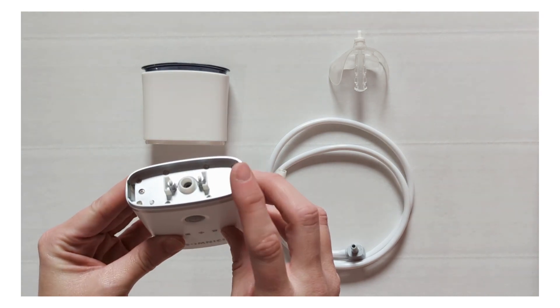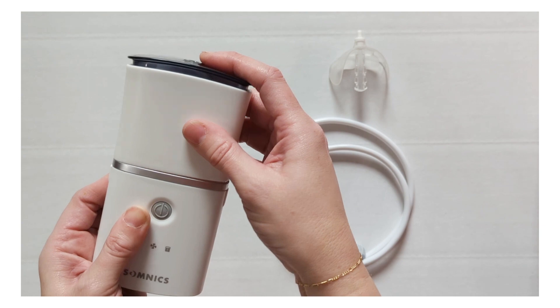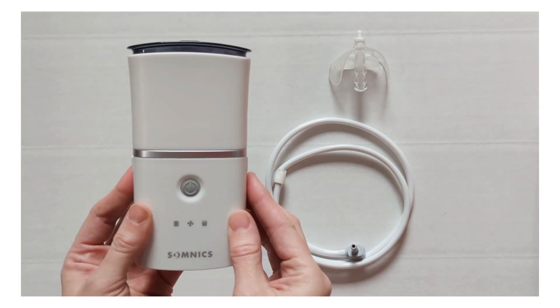Now we'll take our console and connect the saliva container to the console. Ensure you hear the click and that both sides are securely snapped in.